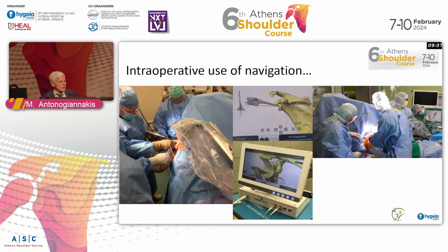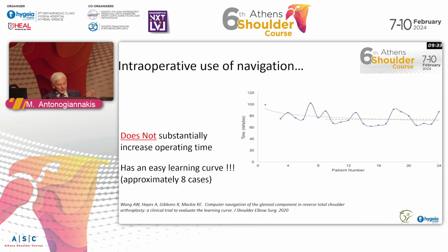Fine, and we started using a navigation system, an electromagnetic navigation system. We say that it did not increase the operating time, but the reality is that it increased the operating time a little. It's not only the time of the operation; you have to bring all the instrumentation into the operating theater, put it in place, get it ready for use, and all this was extra time.